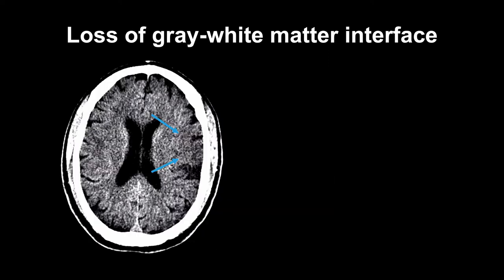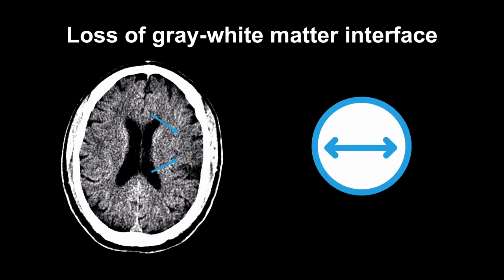On this image, the arrows indicate focal loss of the normal borderline between the gray matter and the white matter. Look carefully at the other side to see what that interface should look like.